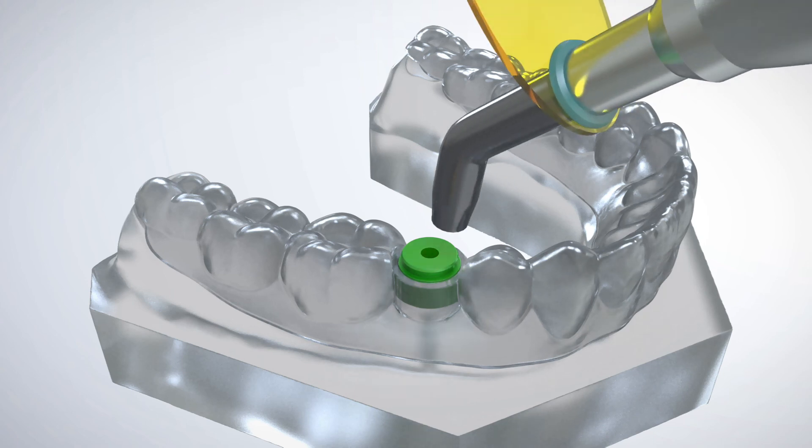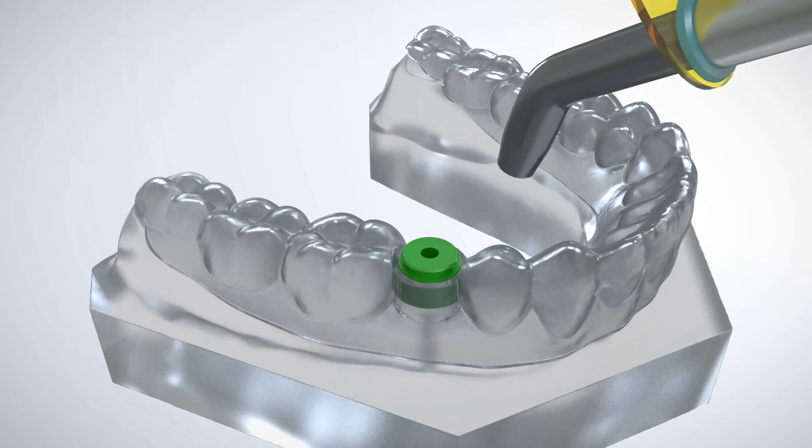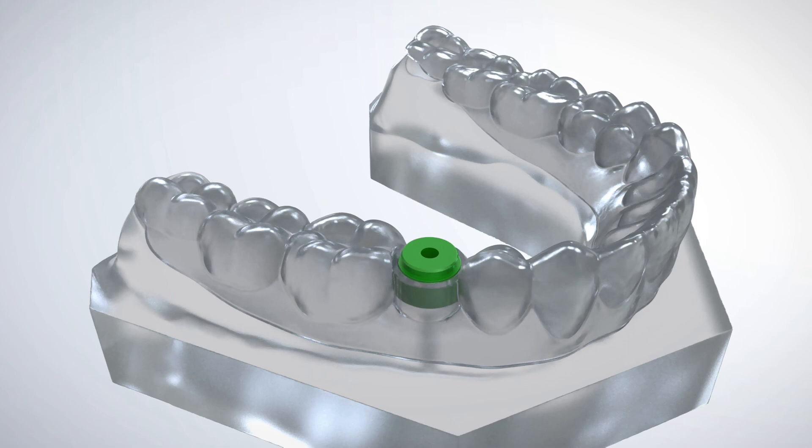A dental light cures the adhesive to create a strong bond between the GRS ring and surgical guide. The GRS surgical guide analog is simply removed using the IR tool. The surgical guide is now ready to receive all GRS drill sleeves.